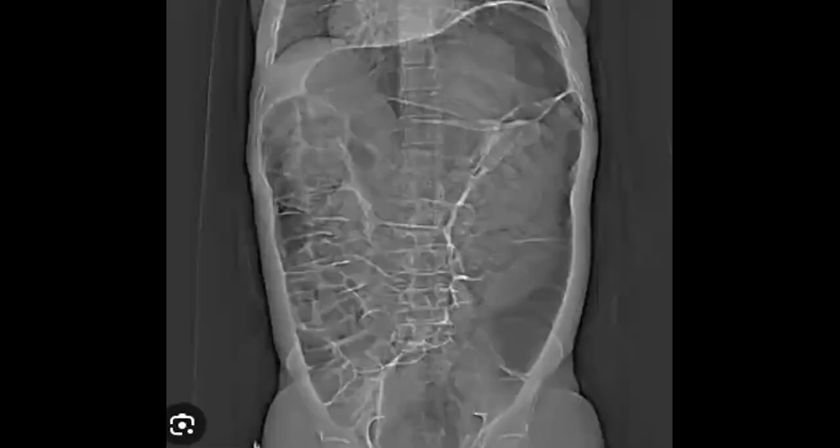There is one situation, maybe I can show you a picture of this, a type of condition where this patient has a chronic dilatation, not acute, chronic dilatation, and even chronic marked dilatation. And there is no transition point. There is a type of ileus that can affect, yes, exactly, the colon: Ogilvie syndrome, or colonic ileus, or colonic pseudo-obstruction.